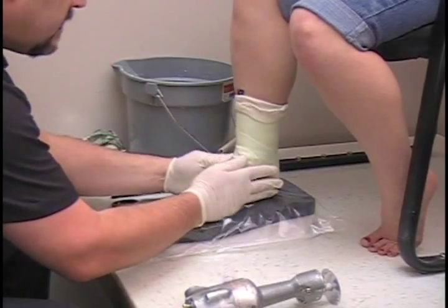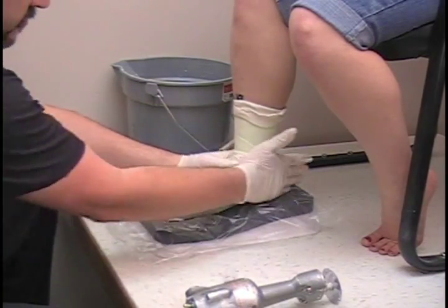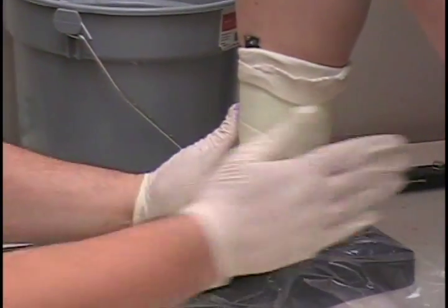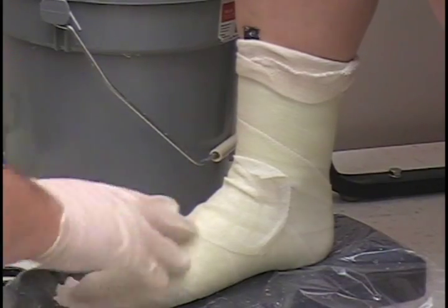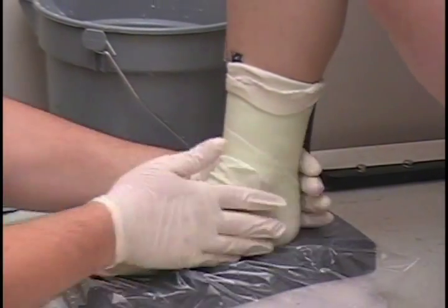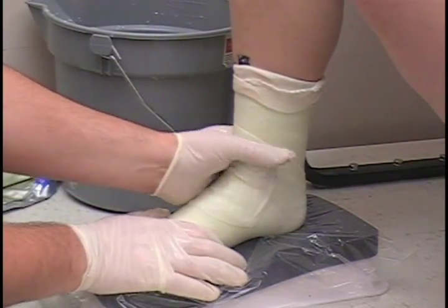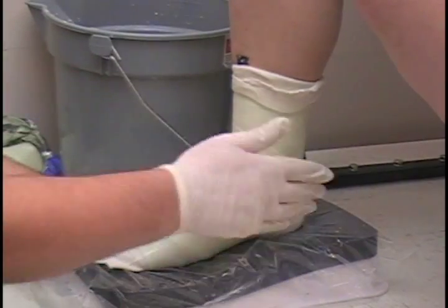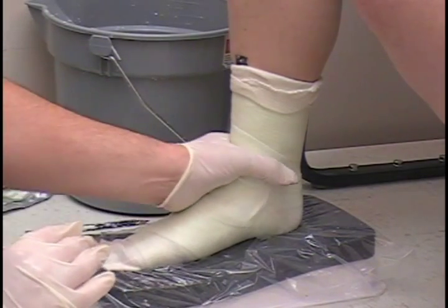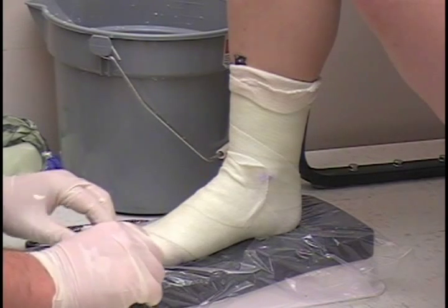Set it in position, back 90-90. For this particular cast, you really want to get your hands soaked wet — that makes the material set off quicker. Massage in the arch, just making sure everything's massaged in there well, and making sure the cutting strip is still in place. This is very similar to having a cast, so if you've ever had a cast before, it's a very similar principle.